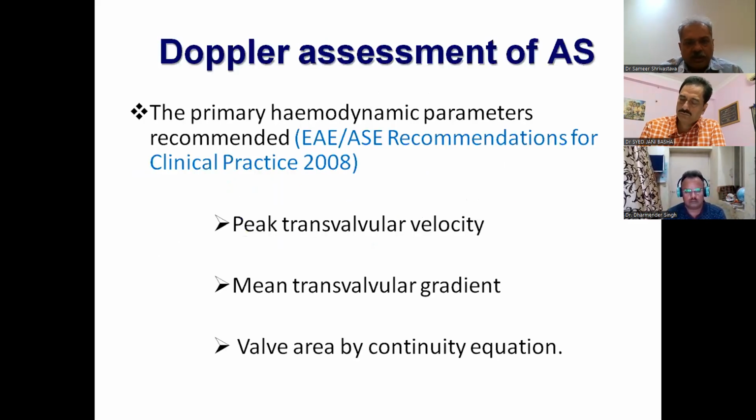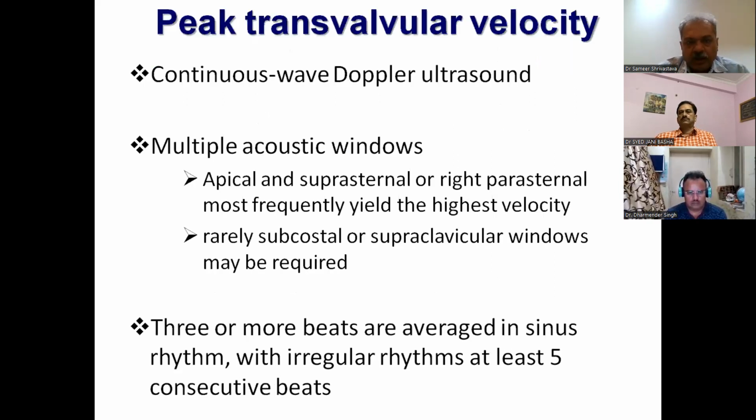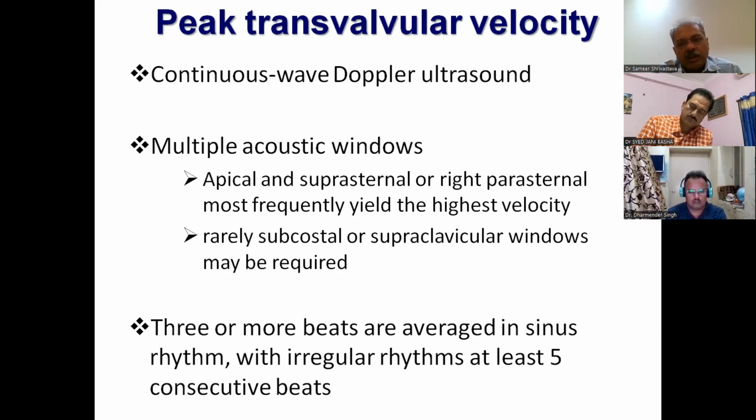Now, how to assess aortic stenosis? Doppler came out with 4V squared, and that has become a bane for most echocardiographers. And unfortunately, or fortunately, it was this which was the gold standard for all practical purposes for severity till very recently. So you can measure the peak velocities, you can measure the mean velocities, and you can measure the valve area by the continuity equation. You should use continuous wave Doppler because velocities are very high in aortic stenosis. And the moment you start using any other Doppler, say for that matter pulse wave, aliasing will occur and you'll get all sorts of erroneous or artifactual readings.